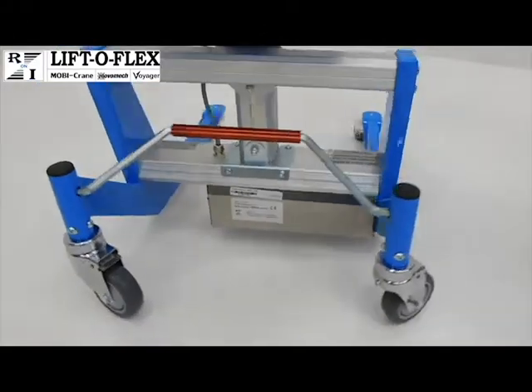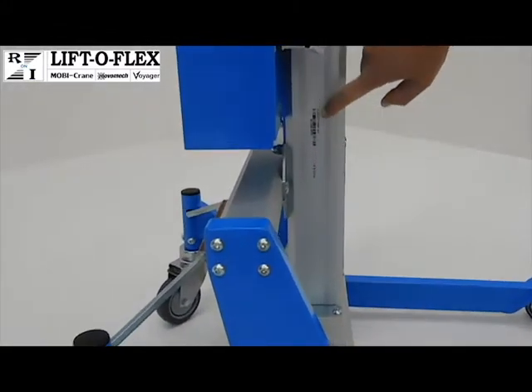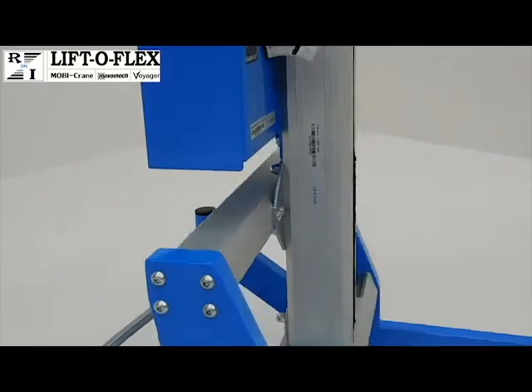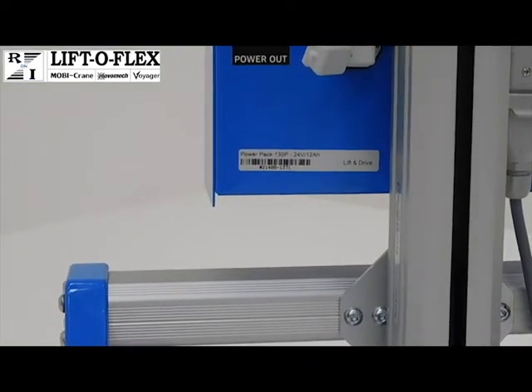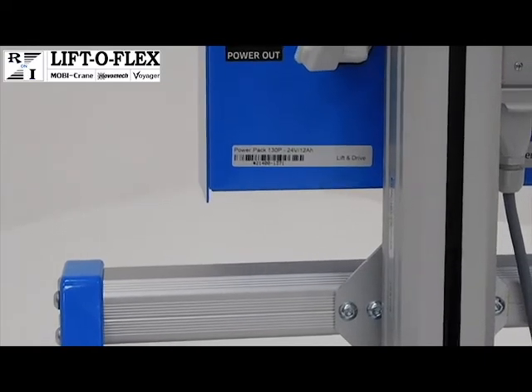The other options you have is on the lift mast. The lift mast serial number is located here, or the power pack serial number, which is located on the back side of the power pack. Any of these serial numbers are also able to be cross-referenced to determine what lifter you have.